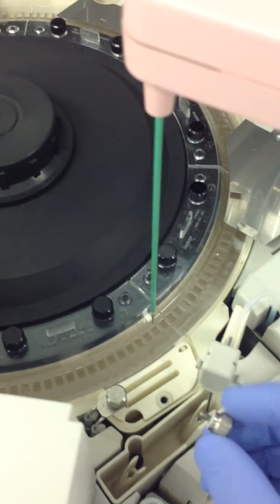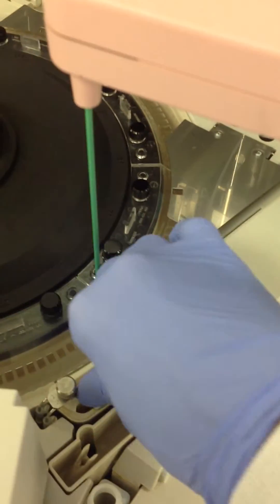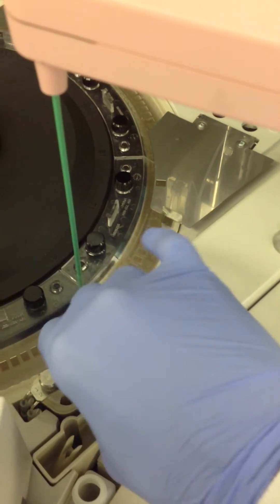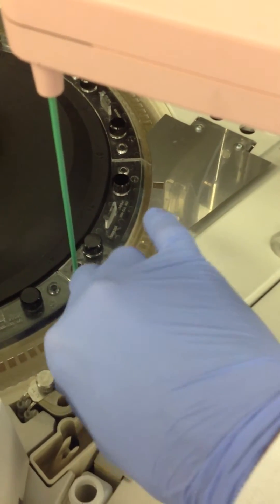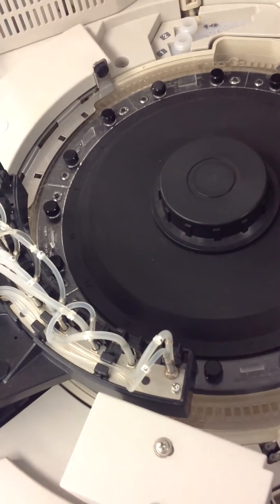You don't want to tighten the screws on too tightly because you want to try and avoid cracking it. Okay, so we got it back in there — not too tight, not too loose. The probe's back. That takes care of our 501.